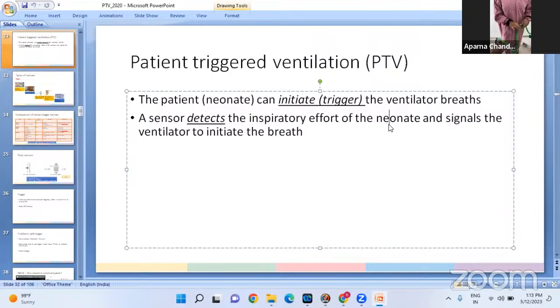So for maintaining ongoing heating and to heat the gases to an additional 1 to 2 degrees Celsius, this is present. So that even if there is a drop in temperature in the circuit, the patient will still get the gases at 37 degrees and at 100% relative humidity. Now, while coming back, of course, there is no heater wire, and hence there will be automatically some condensation. In order to remove this condensation, we have the water trap. The water trap is to be periodically emptied. Now, disconnecting the water trap will not result in disconnection of the circuit.